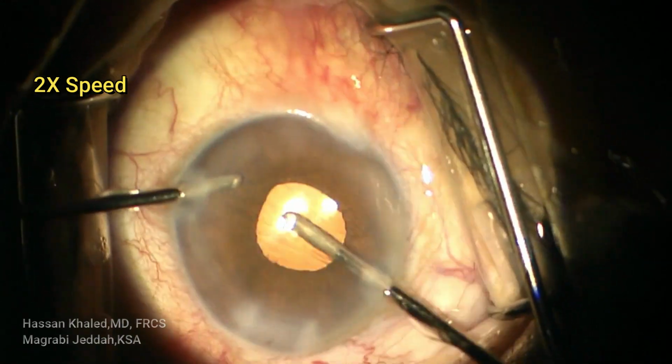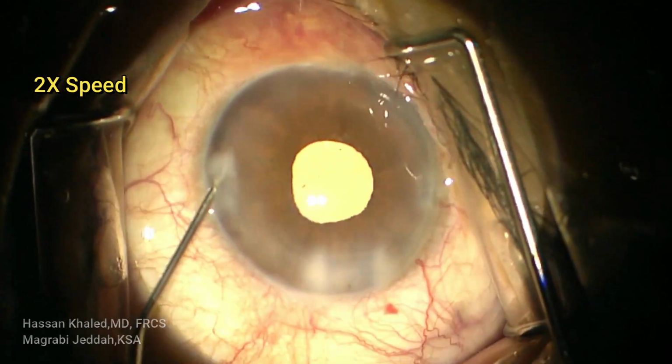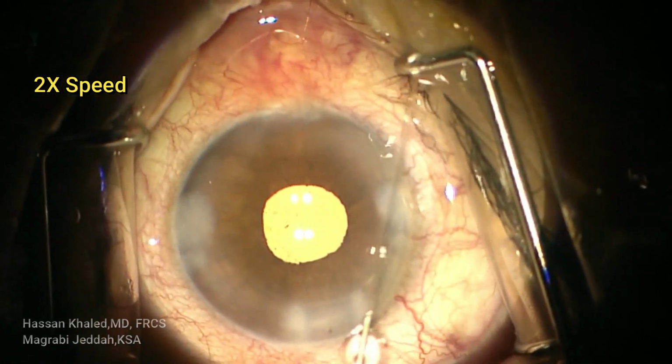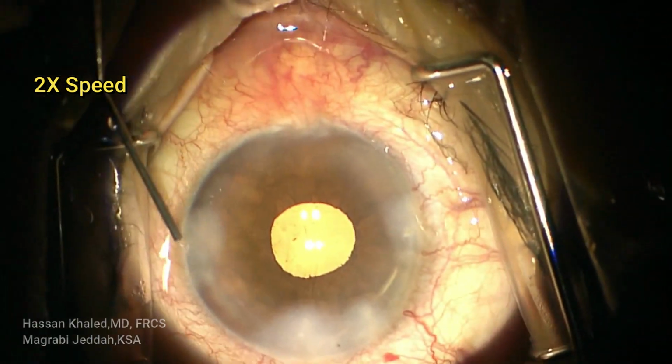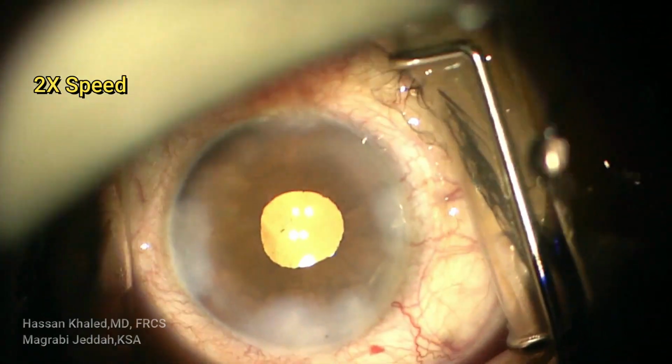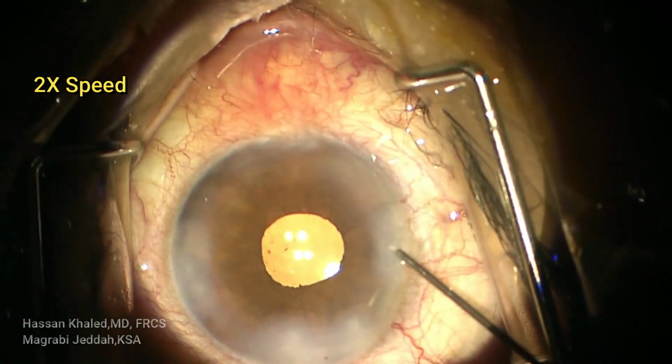By the end of the surgery or during the follow-up, now you can see the pupil. It's about 2.5 millimeters or 2 millimeters in diameter. You can see the hydration of the side port and the main incision. The surgery went very well with this vertical chop technique.